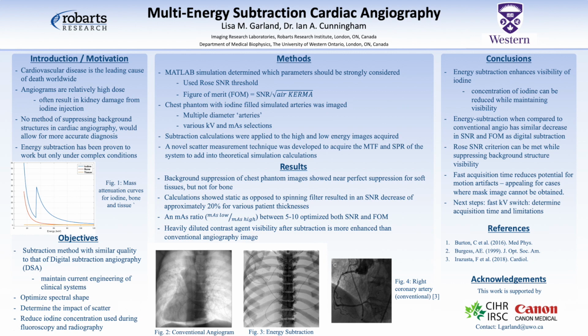Next steps for my research is to implement the fast kV switch that we will soon have access to and determine pulse width parameters and timing of the image acquisitions to further develop this technique and make it ready for clinical testing.